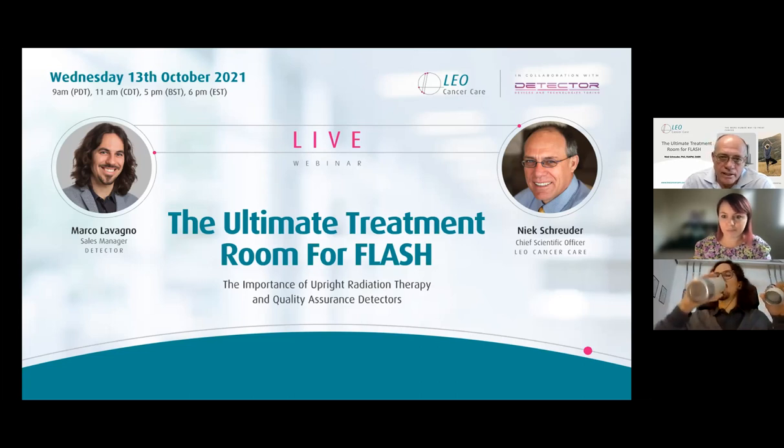Now, when it comes to flash, this question is of course much more relevant. The big unknown is, what is the work rate? Are you going to treat 5 patients per hour with flash, which means the dose is now 20 or 30 gray, which all relates to more protons? Clearly there are a lot of questions out there, and we need to do the evaluation based on that kind of dose rate, and also the fact that you have to degrade close to the patient. So we're still looking into that paradigm.